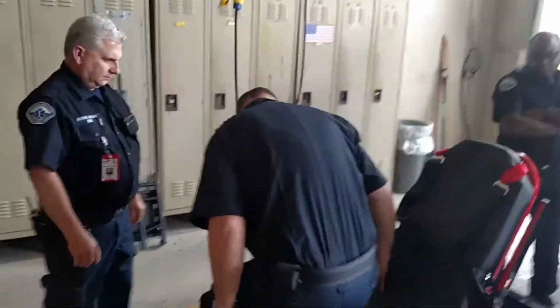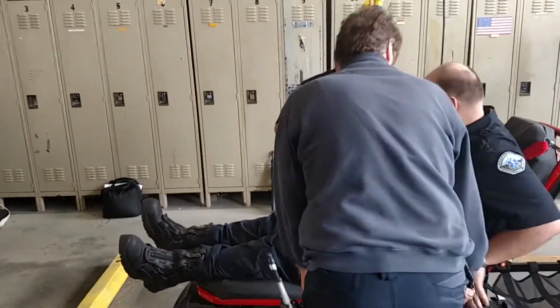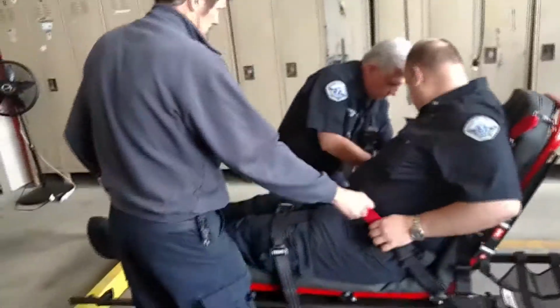I mean, I like this. You have gravity telling those legs to come down. Right. You have a machine telling these legs to come down. But it's no different from any other power cot. I can tell you, these legs move faster than any other power cot. Bolting out slightly left, buddy. I mean, no, I like the whole system.